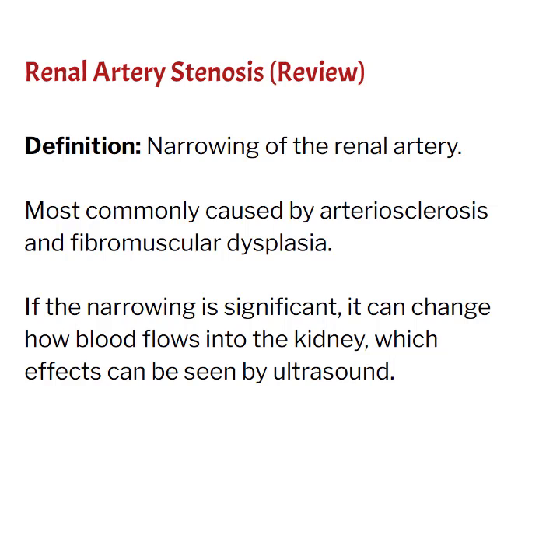The other more common reason is something called fibromuscular dysplasia. Now this is going to be seen in younger women typically, and what happens is that the muscle wall becomes more rigid, more fibrous, and when that happens, the walls kind of crunch down on themselves, causing that narrowing. On ultrasound, we call it the string of pearls effect. It looks like little balls along the length of the vessel.